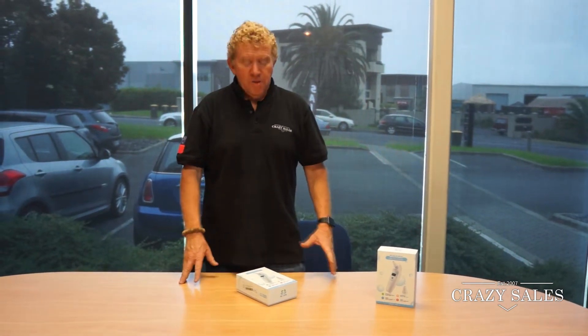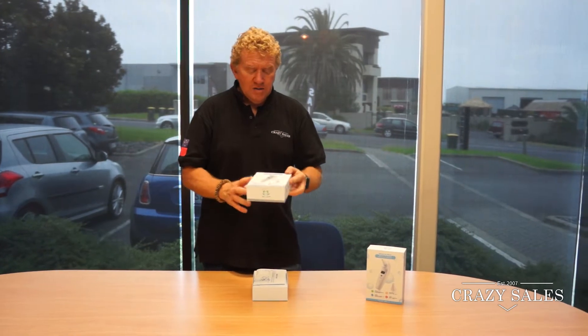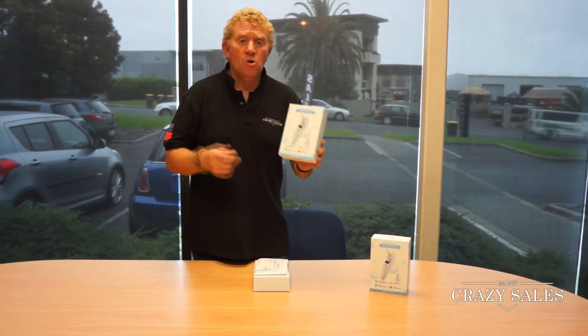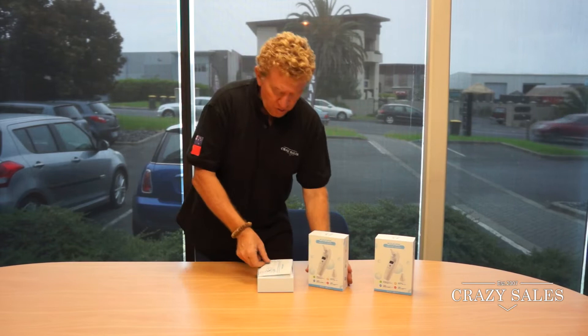Hey, Jimmy at Crazy Sales here. Winter is coming along soon, so time to get your Bluetooth air thermometer. These are really handy for taking the temperature of the kids or your loved ones when they're not feeling too good. They're pretty cool.